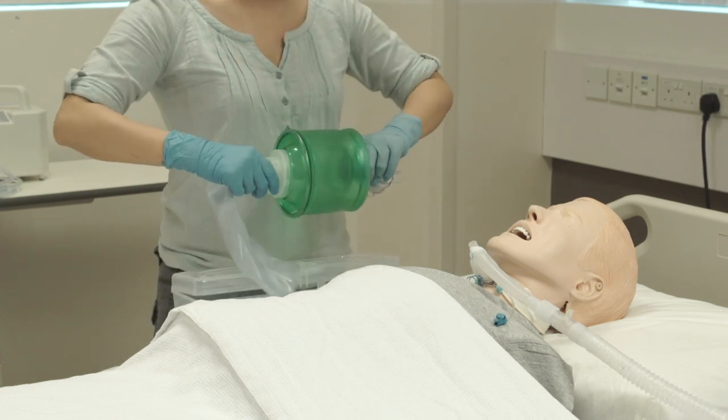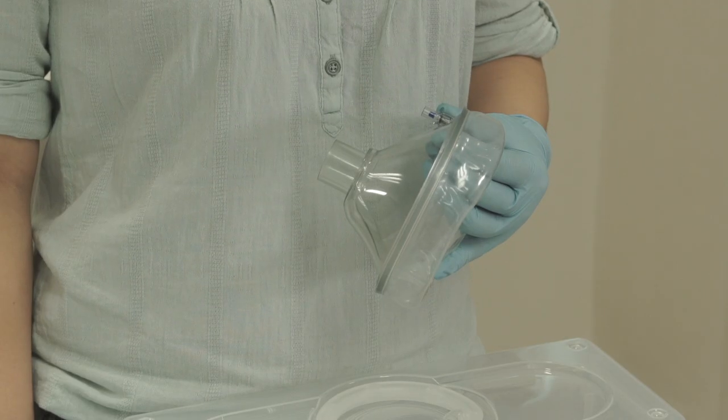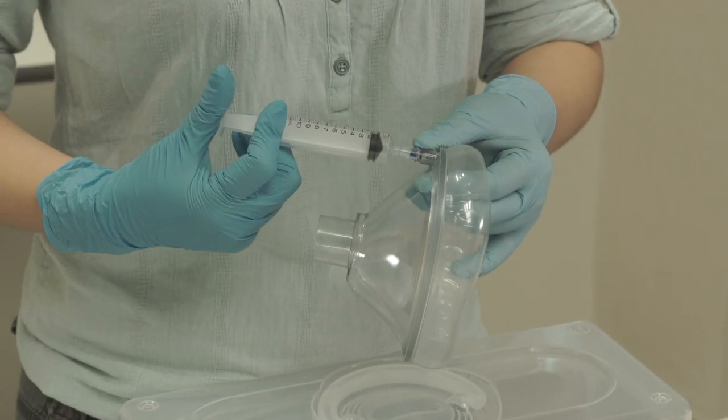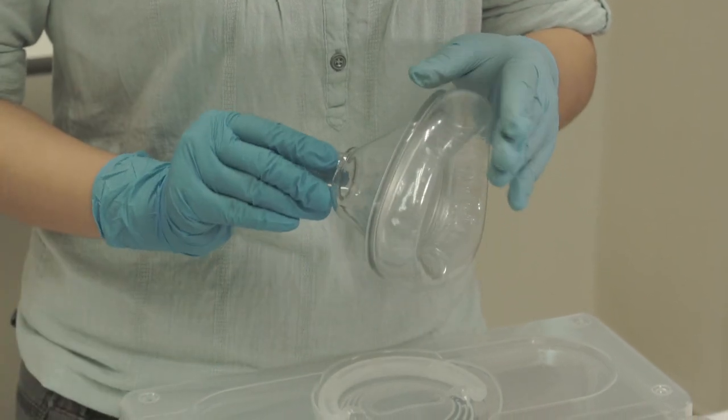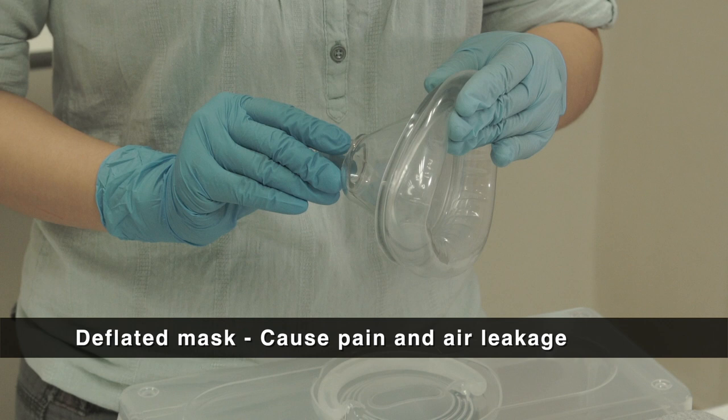Assemble the Ambu Bag and check for self-filling. Ensure that the face mask is well-inflated, and inject more air if needed. A deflated mask may cause pain and air leakage.